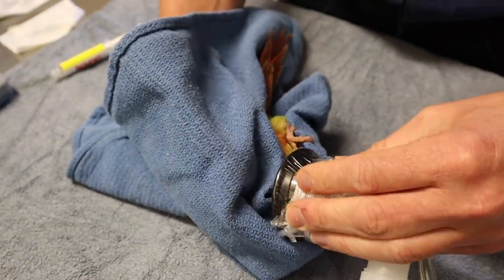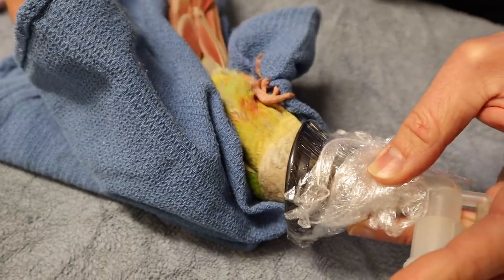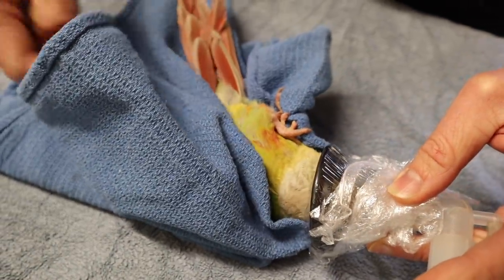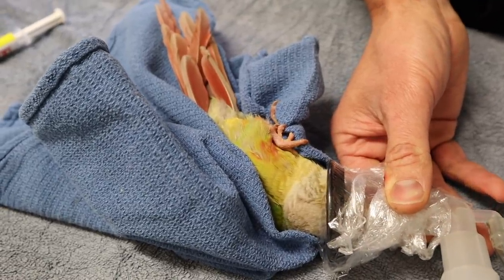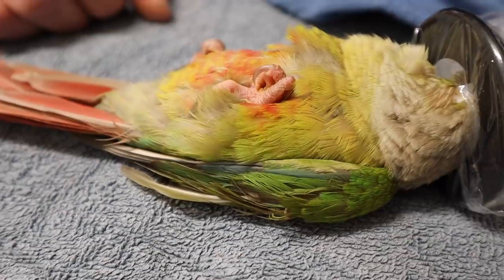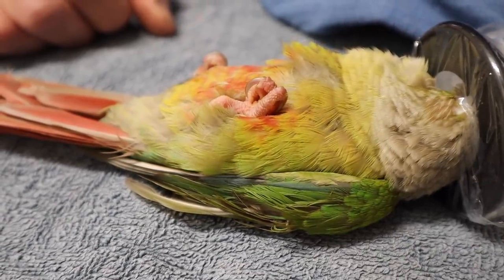Here we are just anaesthetising this little guy for his microchip. It's a very quick anaesthetic, but generally if I get less movement, I'm less likely to get any significant bruising — and that's the main issue with putting microchip implants in. Because it's a quick anaesthetic, we just use a quick mask. We're not going to intubate this little guy.